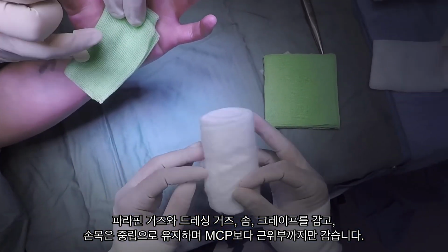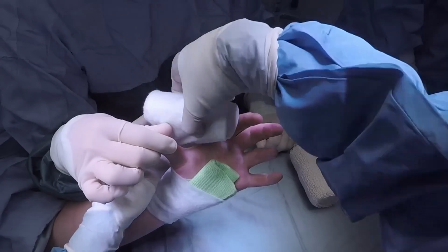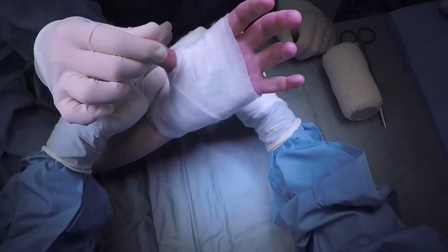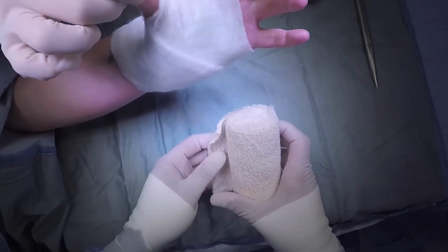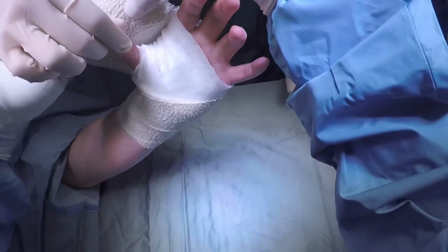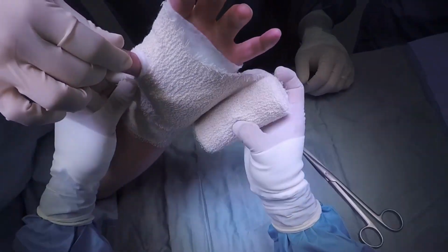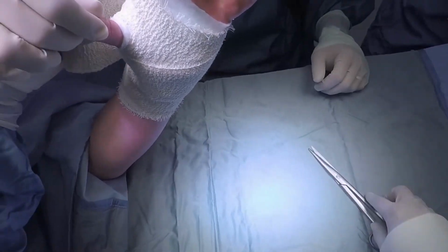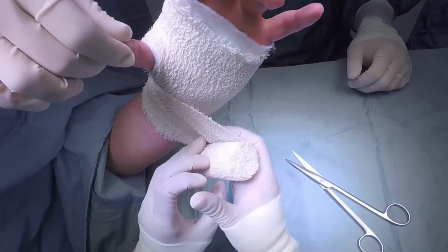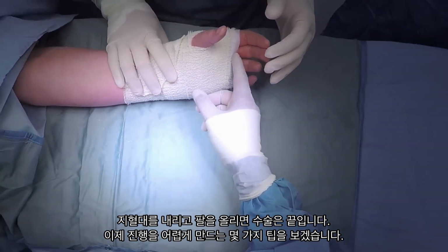Naturally, if you have a preferred dressing type or technique, you can use that instead. Lower the tourniquet, ensure limb elevation, and you're done.